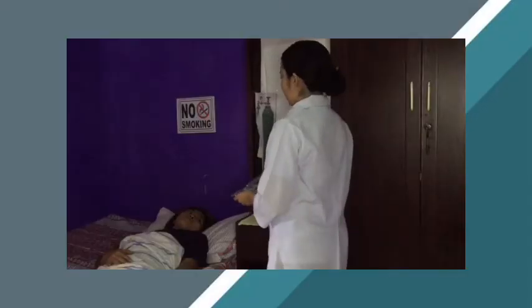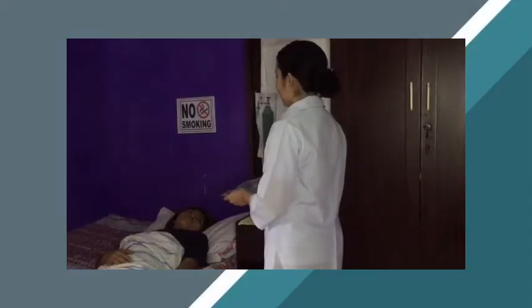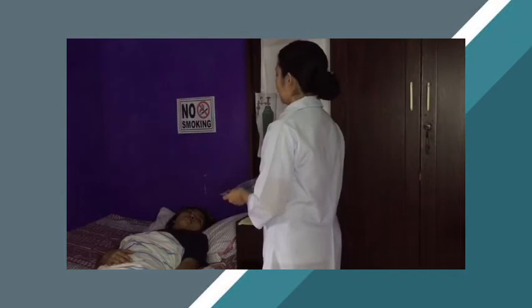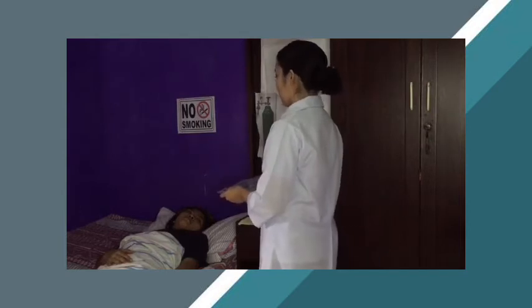Ibibitay ko po sa inyo itong oxygen mask para po magkaroon kayo ng sapat na daloy ng oxygen sa inyong katawan.